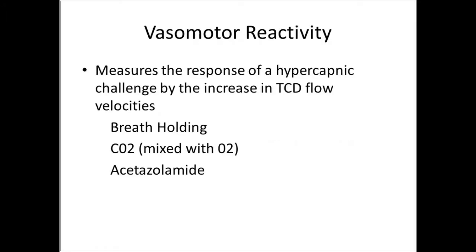So vasomotor reactivity measures the response of a hypercapnic challenge by the increase in TCD flow velocities. And we can do these tests by breath-holding exams, administering CO2, but it's always mixed with oxygen, and the administration of acetazolamide.